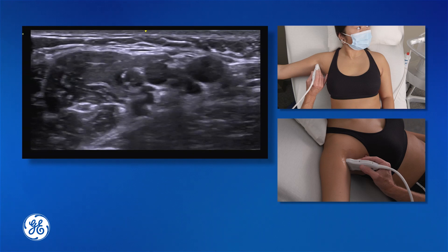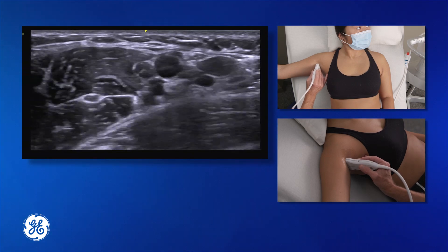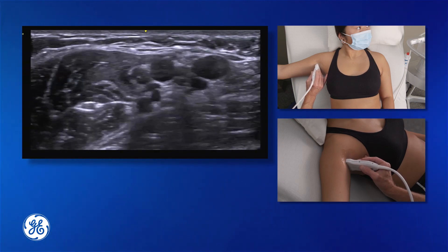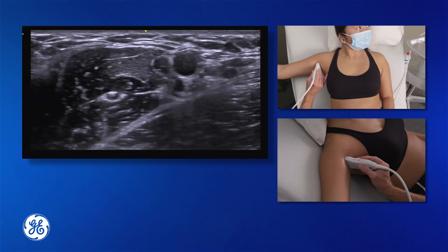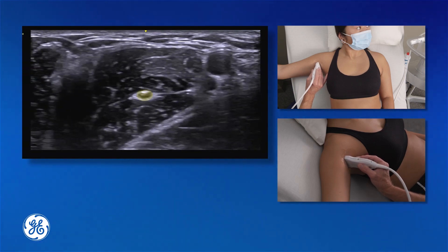This is a very good block for surgery from the elbow down to the forearm and the hands. You may choose to do any one of the other brachial plexus blocks depending on your skill level. Or, if you decide that you do not want to move your needle around, I will individually target these nerves — choosing to block the musculocutaneous first.